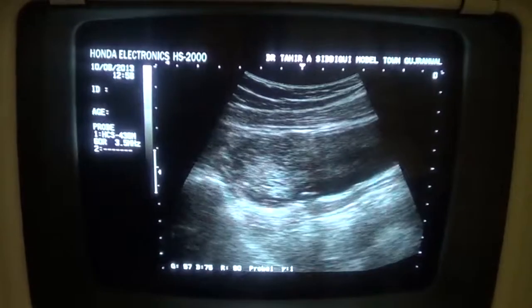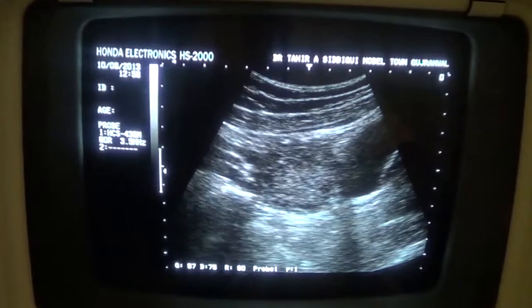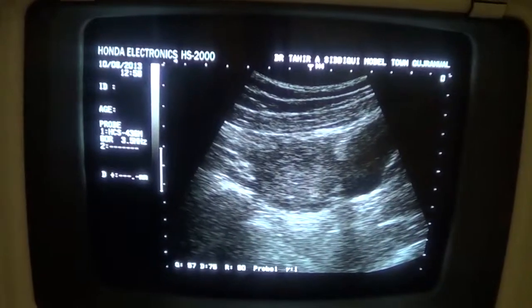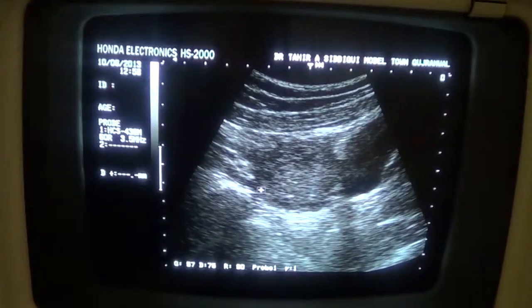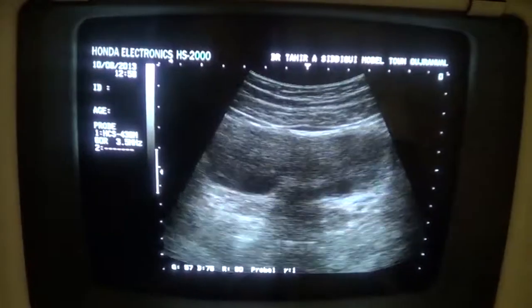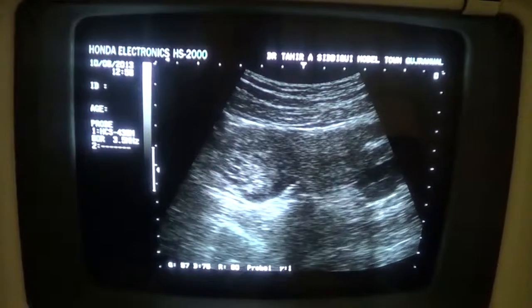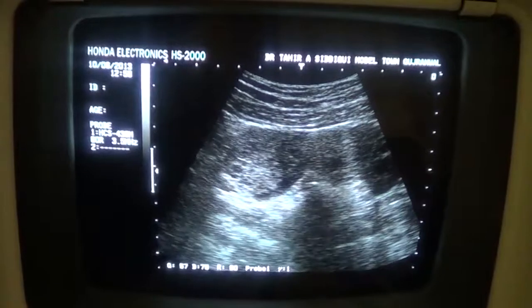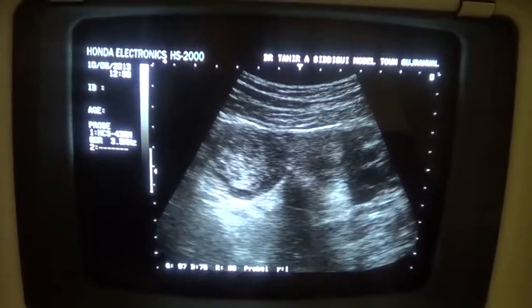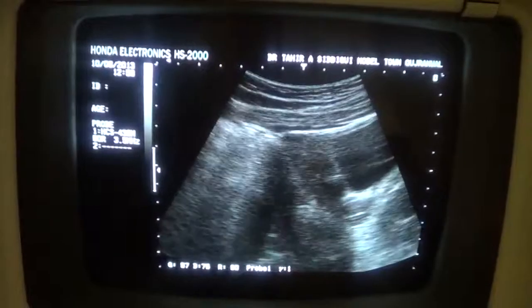And we cannot rule out the possibility of an aggressive pathology. See the landmarks of this structure. These are the iliac vessels. So this is an ovarian cyst. Rest all of the ultrasound is unremarkable. So such cysts require further evaluation, keeping in view the age of the patient.